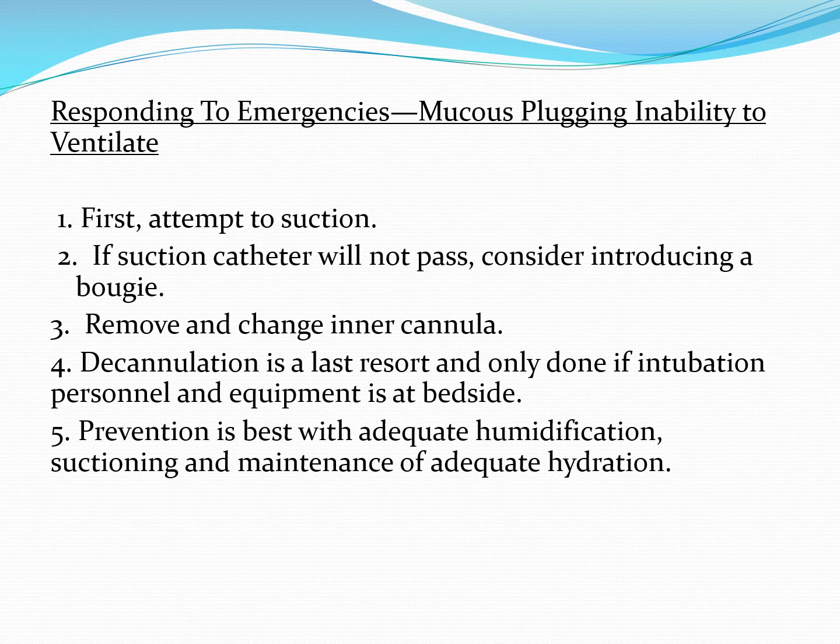A bougie is a device, sometimes referred to as a gum elastic bougie, that some clinicians will use as a guide, not literally a guide wire, but a guide-like wire, so that it can be passed through the vocal cords and the ET tube threaded over it. Bougies can also be used if there's a mucus plug that will not come out and you've tried all the obvious stuff; you can try to pass a bougie through.